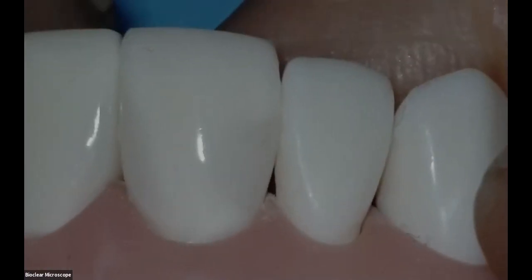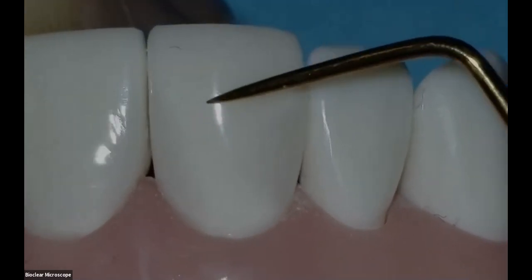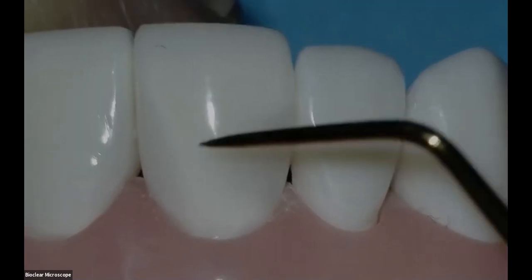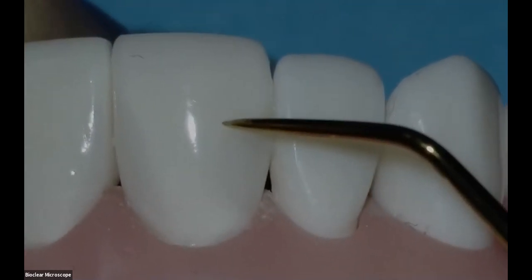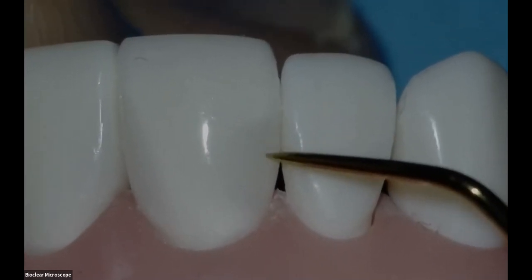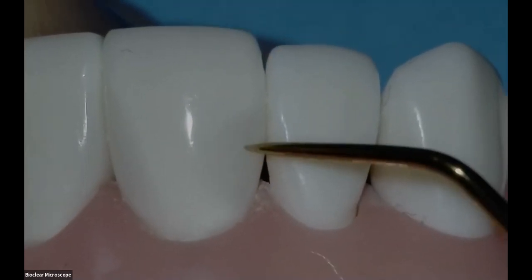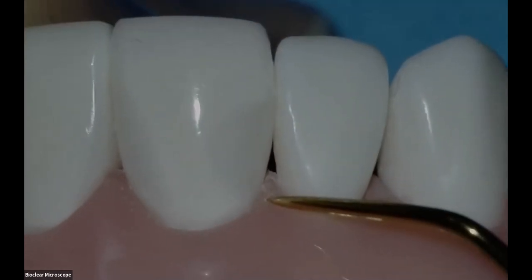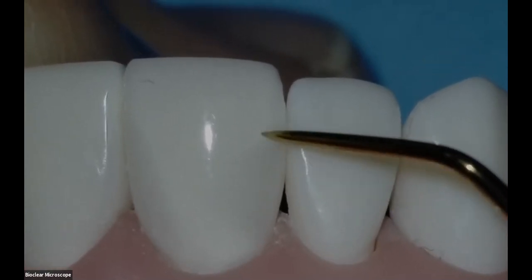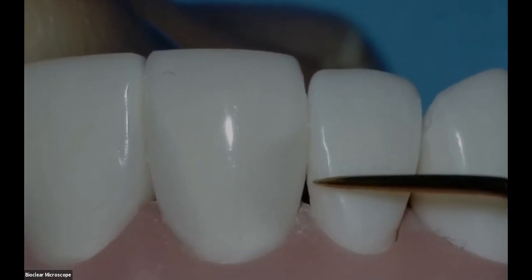The next tooth that you'll see here is where we did 2 things correctly. This tooth was treated, we did it in a webinar the other day. I didn't do the radius bevel. On a deep class 3, we do have to prep the tooth with the radius bevel. And Disha, can you see that there's just a little bit of grayness there? We did the Bioclear method. We used Filtech Supreme Ultra, but we did not do the radius bevel. And you can see that there's a change in the color, you can see the difference between the composite and the tooth. Can you see that, Disha, or not?